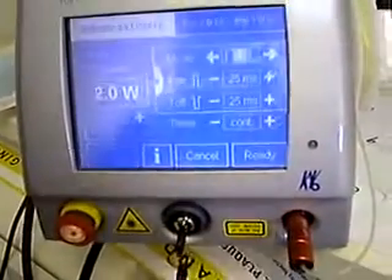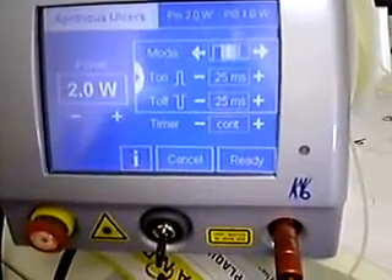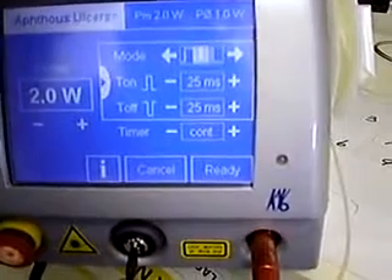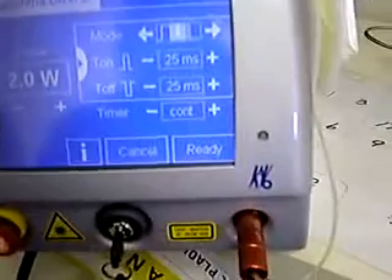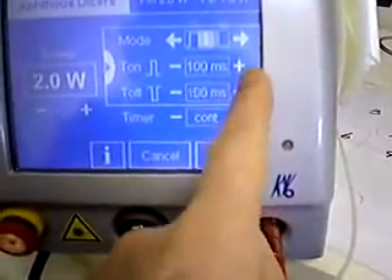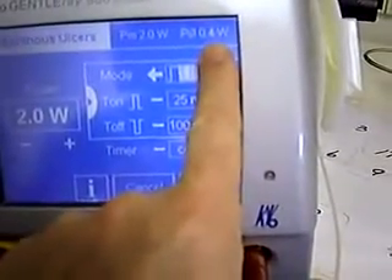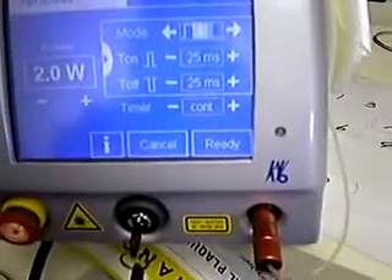You press OK and then you get a setup screen which lists the mode — pulse or continuous wave. Up on top it tells you how much power is anticipated coming out of the laser tip. You get about one watt out, and you can set the time on and time off for the laser. By changing those settings, you change the amount of power coming out of the laser tip, so you've got a lot of control with this laser.